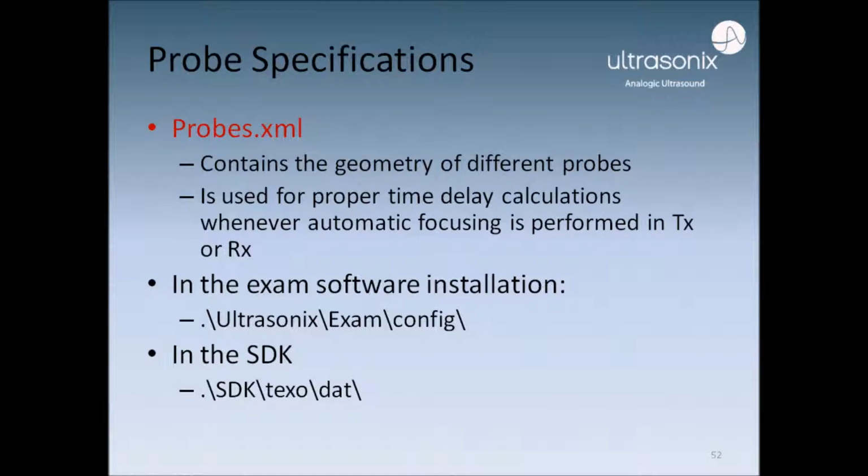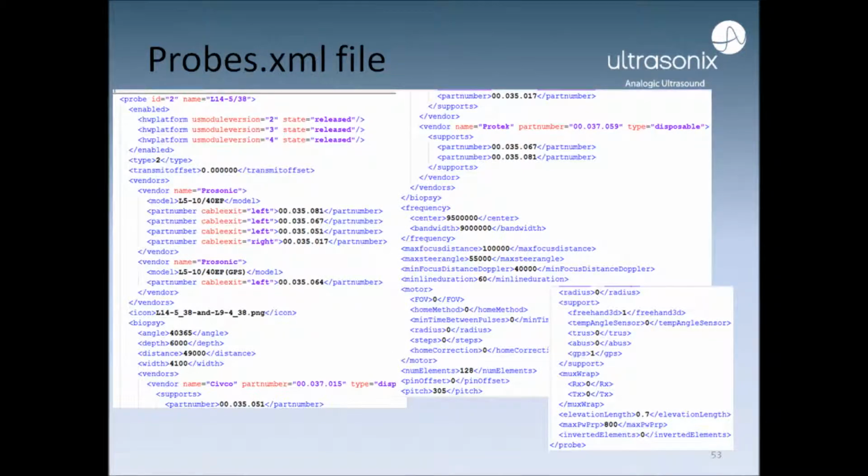The probes.xml file can be found in the exam installation under ultrasonix/exam/config folder and in the SDK under SDK/texo/dat folder. Here is a snapshot of the contents of the probes.xml file for a typical probe.